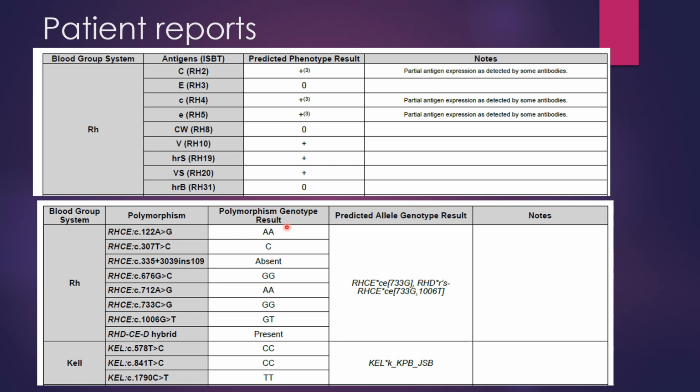So you can see this patient only has 2 A's, so they have a normal reference allele. And the bioarray test is a little bit different. We'll talk about that on the next few slides, but that is something that's really nice about this assay, is it actually tells you what nucleotides are detected in the assay.